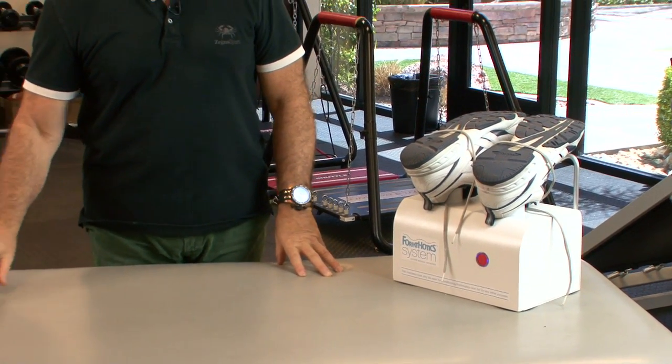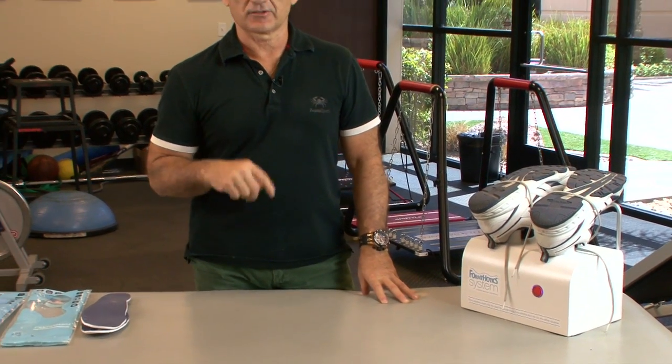Now the patient, unlike with most other orthotics, I want my patients to get in these and walk around for a couple of hours. Because it's softer and it's heated, it will start molding to that patient's foot.